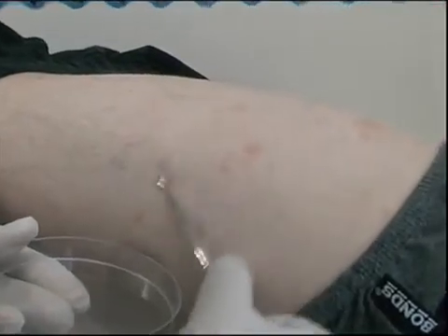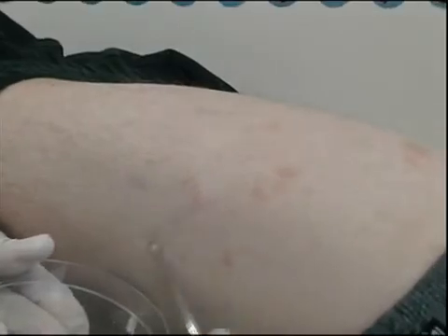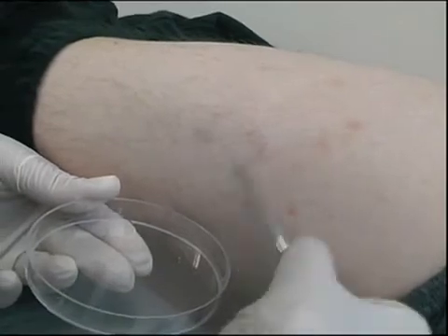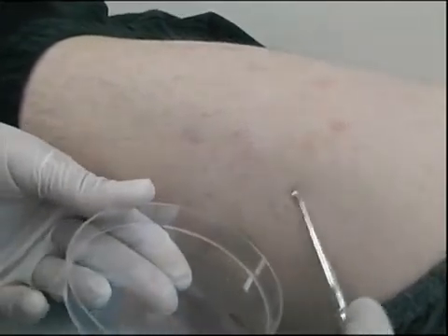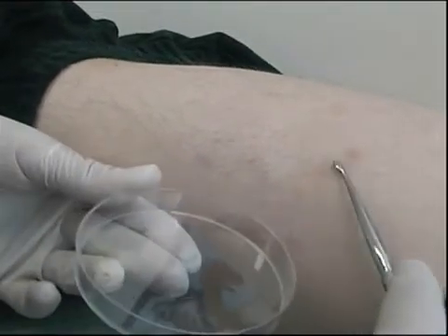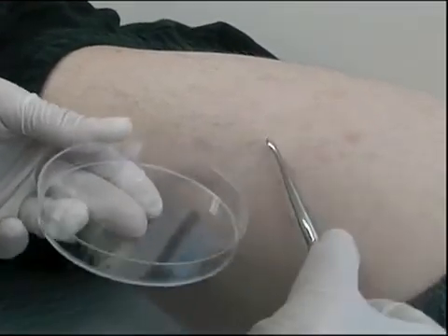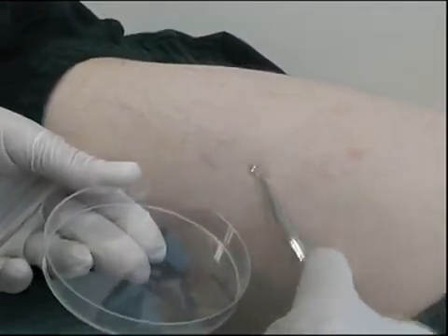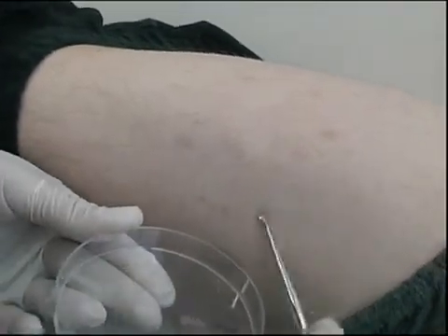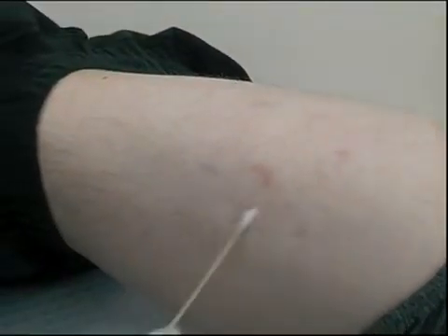Here we see a bone curette being used to scrape a diffuse scaling skin lesion into a plastic petri dish. However, a black collection card could also be used to collect the skin scales. A swab is then used to pick up the loose skin scales.